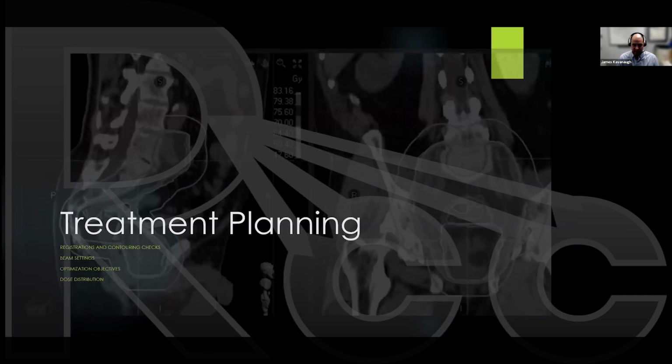All right, pausing again. We had a question about whether you shoot for a super full bladder or whether a half full bladder is more comfortable for the patient. And I think that you mentioned the goal is a reproducibly full bladder, but do you have any suggestions for achieving a reproducibly full bladder?